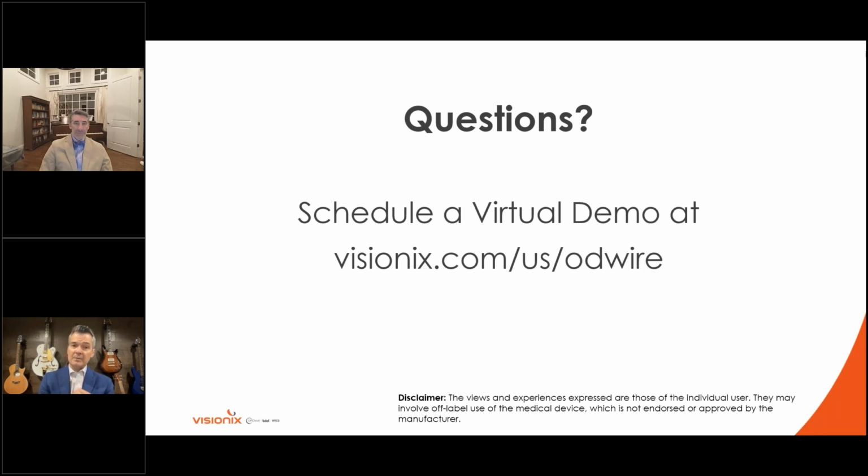That's not sometimes, that's not when we're troubleshooting, that's every single time we see the patient, because we feel that these measurements are that important to really create the best fit and best visual outcome for those patients. So again, make sure that as you get more comfortable with this, you are creating those patterns in your practice that create consistent care for these specialty lens patients.